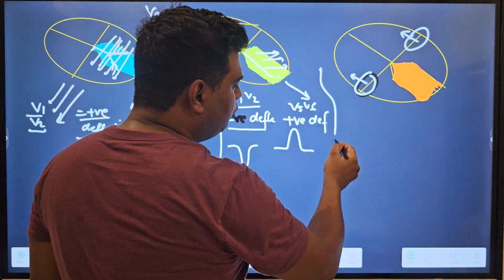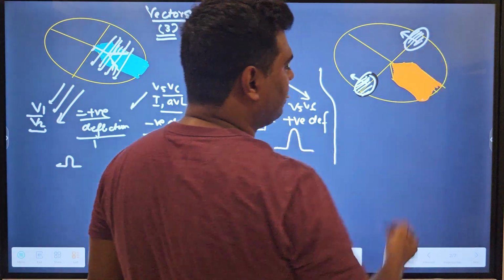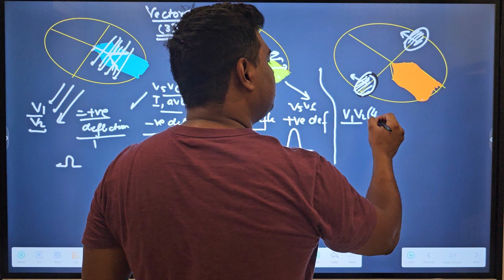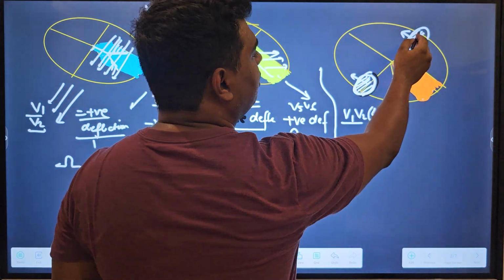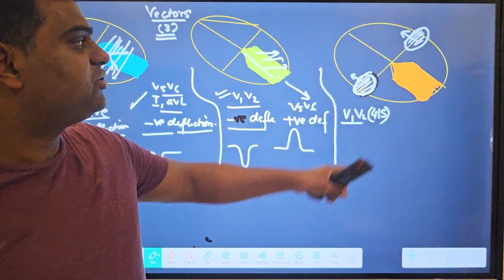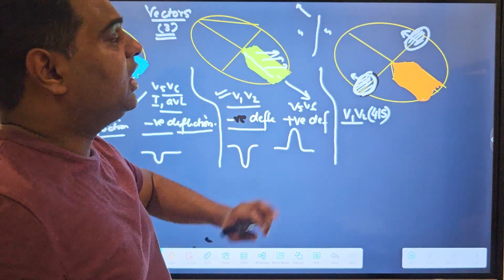Now, the most important thing, finally the depolarization is of the bases. This is the bases, right ventricle and left ventricle. Now we have to understand a very important thing: lead V1 and V2 are normally present in the fourth intercostal space. So this depolarization of the bases of the right or left ventricle is beyond the scope of these leads to capture, because the depolarization wave is much farther away from them, and faster.